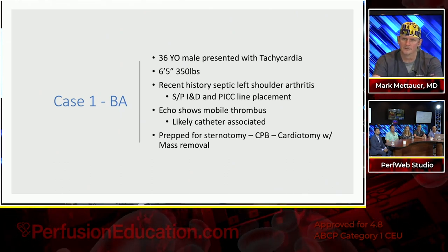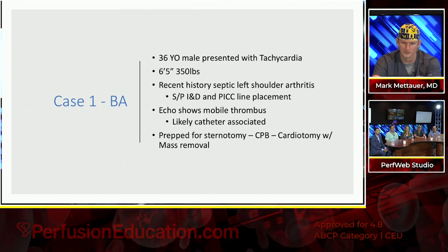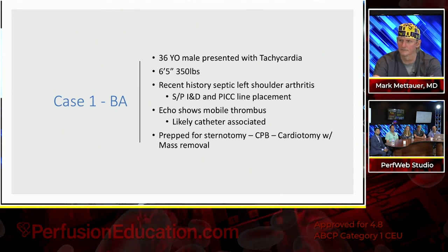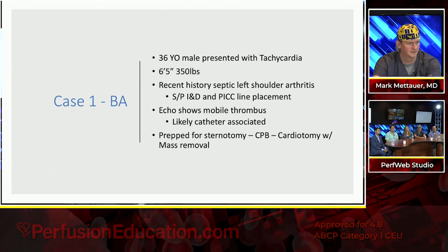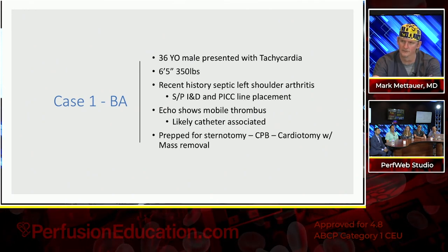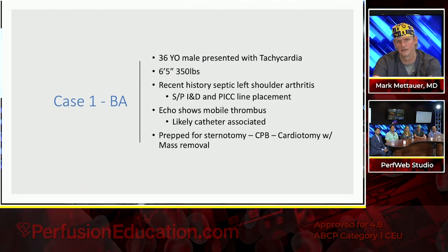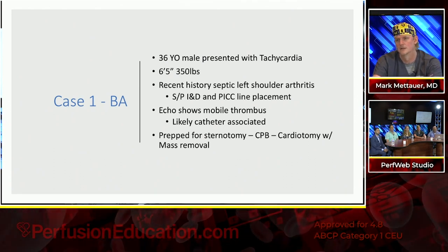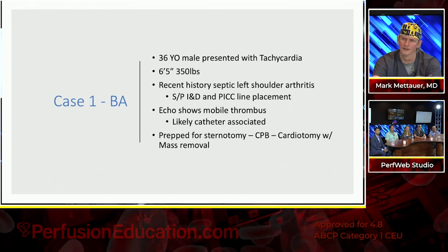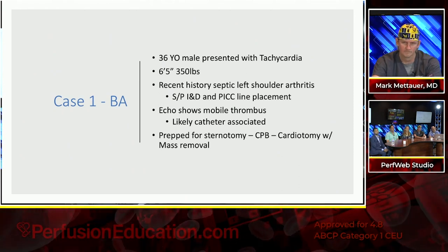So we'll start with this first case. This technology started with a couple of friends of mine that I trained with down at Texas Heart, just the idea of it. And since then it's advanced into this wonderful piece of technology that has really added to better patient outcomes, the ones you can operate on for a massive PE or right heart disease, such as catheter-related infections, mobile endocarditic valves of the tricuspid, pulmonary, et cetera. And so let's go to the cases.